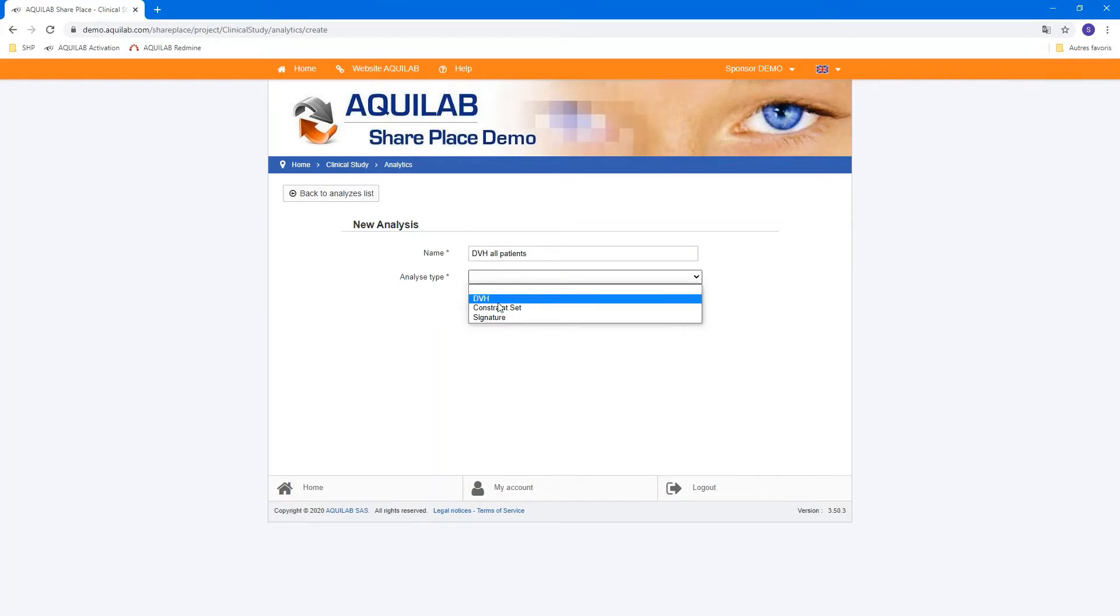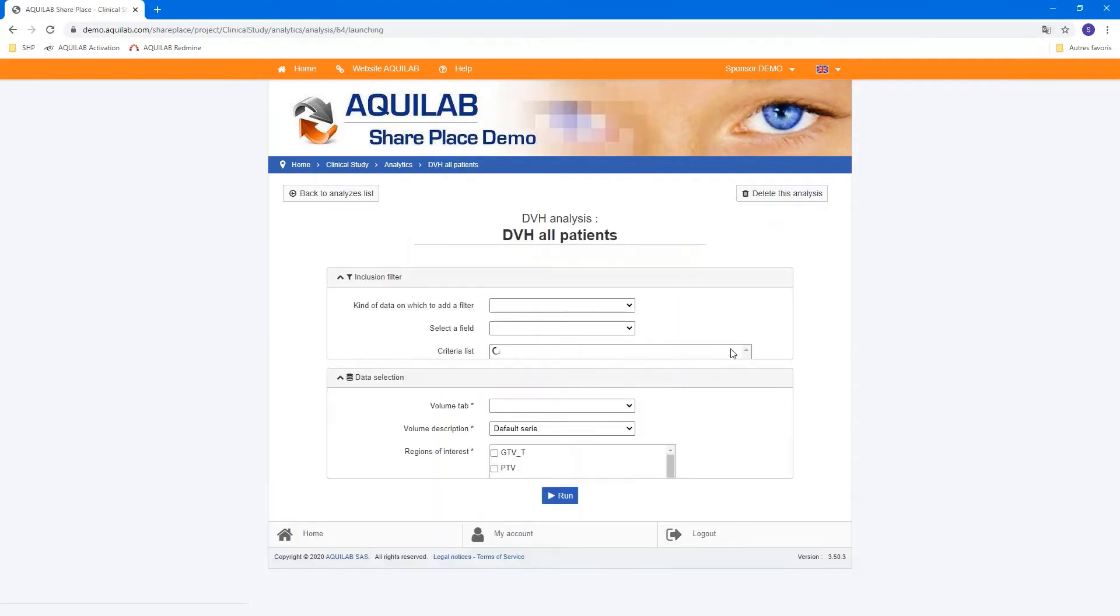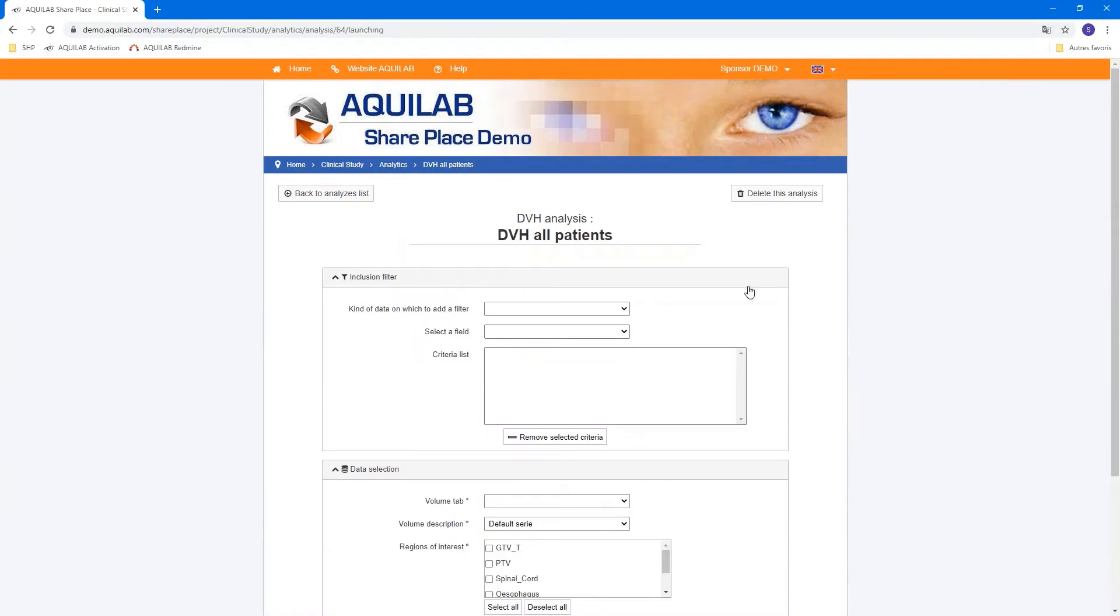We can name the analysis and you have three types of analyze. The DVH, the constraint set, or signature. We can go first in DVH and create this analysis.